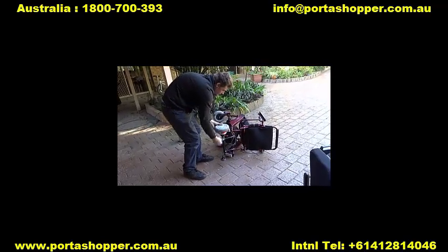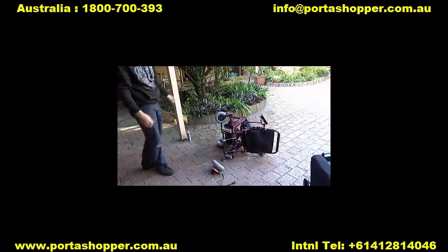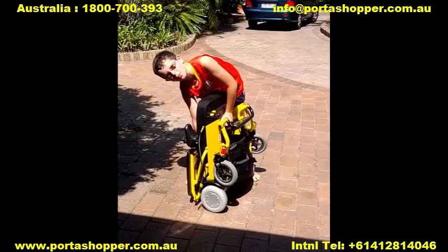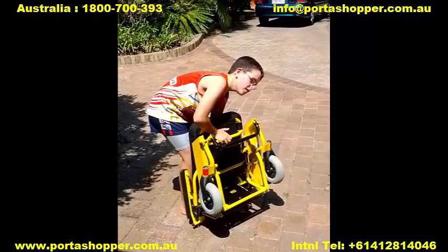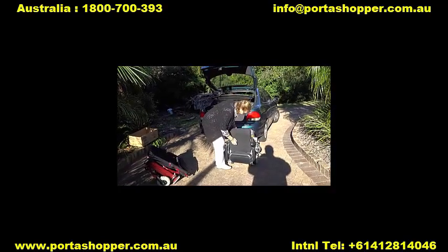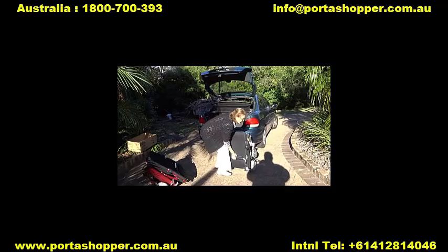Please note that the PortaShopper 2 doesn't ship standard with our patented Big Easy Kit, which allows you to break it into 3 parts as shown in this video, but you can choose the factory fit option or purchase the Big Easy Retrofit Kit and fit it yourself. That reduces the lifting weight of the heaviest part to only 12kg, which is easy enough even for those with impaired upper body strength.